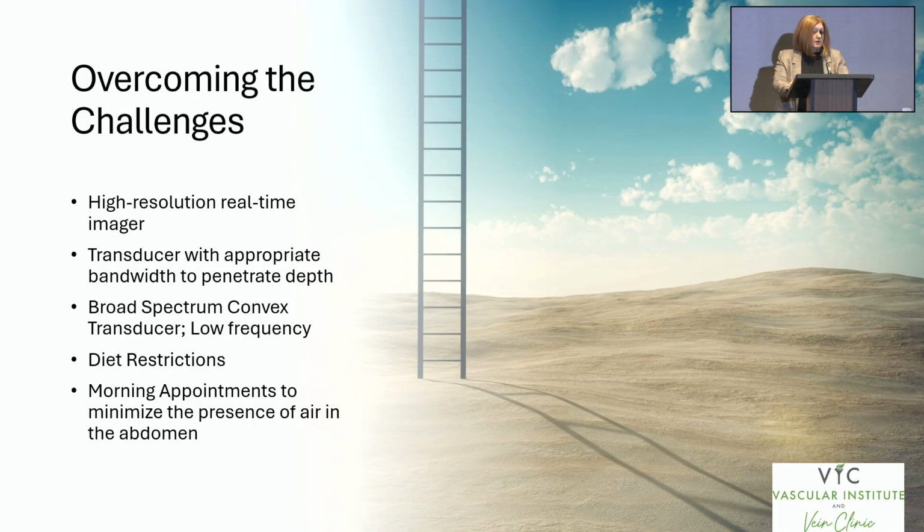Use the appropriate transducer. You want a bandwidth that can penetrate that depth, so you want to use a broad spectrum convex transducer, low frequencies to penetrate that depth. We use higher frequencies for superficial, those lower frequencies to penetrate and for depth.